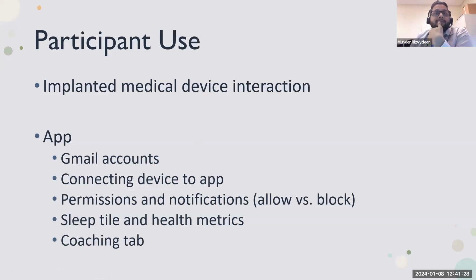We then ask the participant to download the Fitbit app to their phone and log in or create an account. On the App Store, the app is titled Fitbit Health and Fitness. They can just search for the word Fitbit. But the important thing to note is once they download the app, when they sign in, since Google purchased Fitbit, they will need to sign in using a Gmail account. If they have a pre-existing Google account, they can just use that.